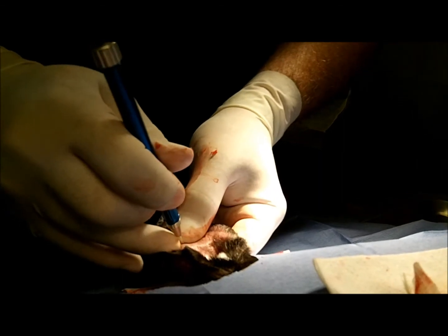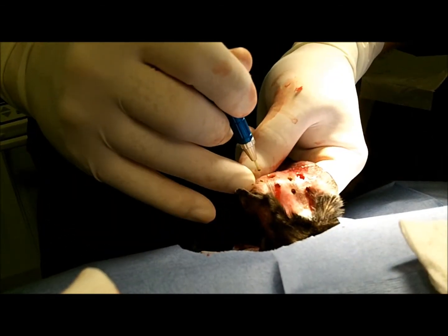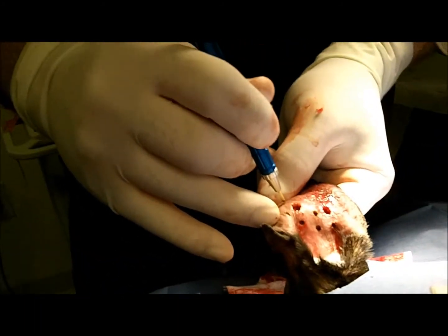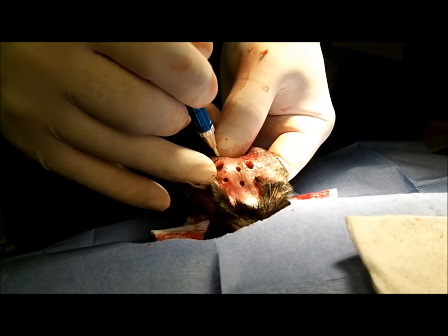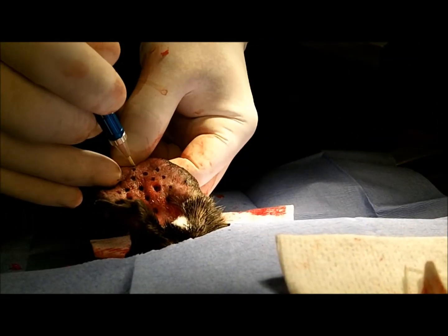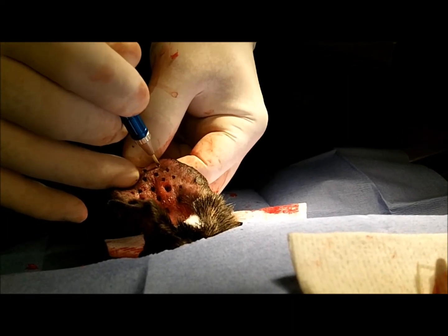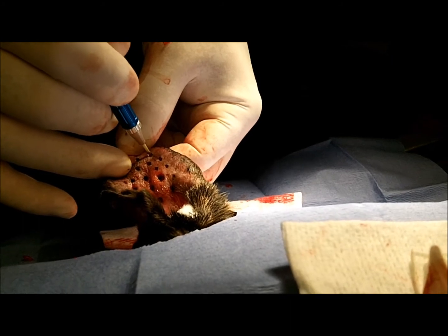We start to do basically a spot-welding tack on there, doing multiple little holes on the ear and welding it to the other side using the laser. You laser all the way through, and you can start to feel the laser on the other side — and that's when you know to stop.